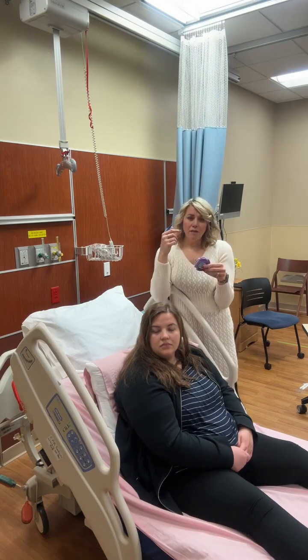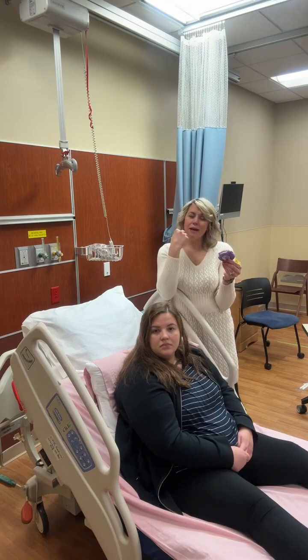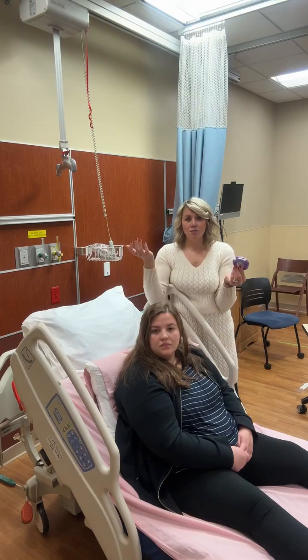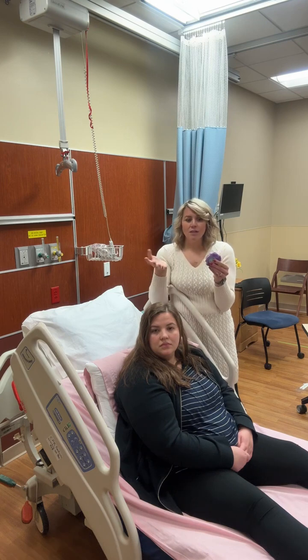And so that is the main reason that when you do a dry powder inhaler, you have to rinse your mouth, because typically that powder is going to go right to the back of your throat. And if it's a corticosteroid, corticosteroids that are inhaled can cause thrush, a yeast infection. So that is why we rinse our mouth and gargle and spit it out for inhalers like this.